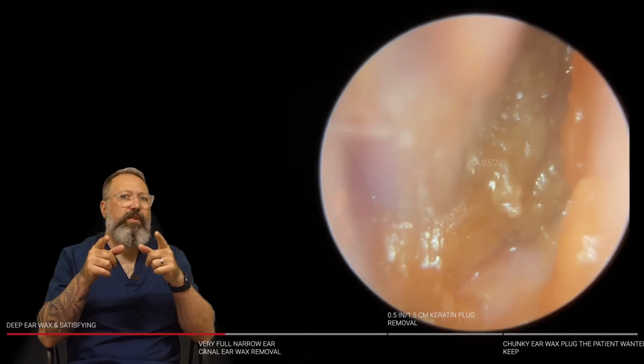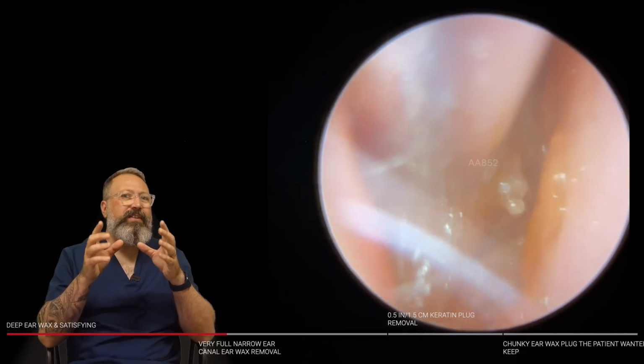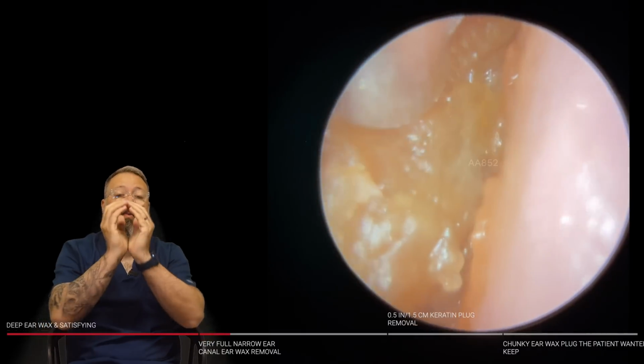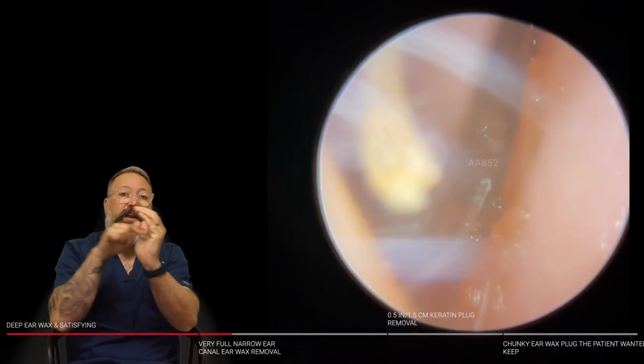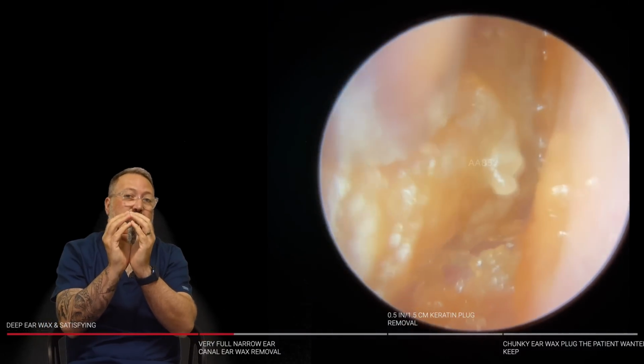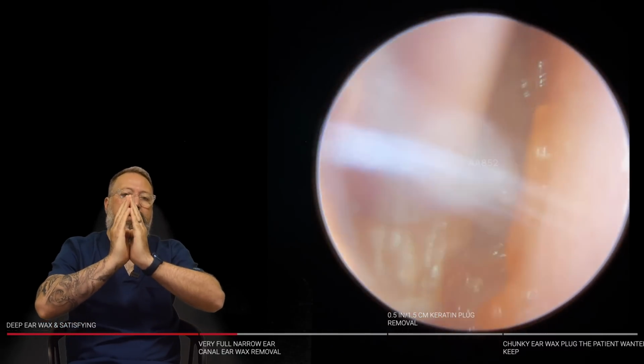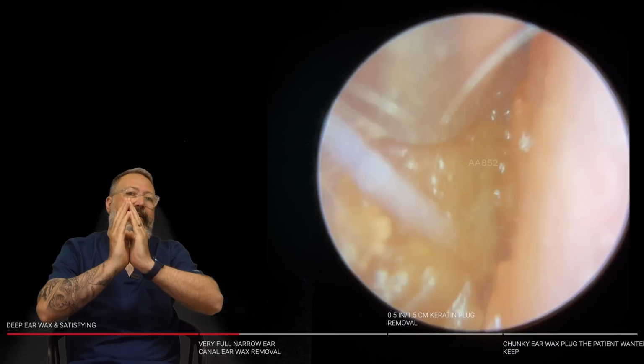Yeah, it's quite a narrow one, and this is hardened up perfectly into the shape of the canal. Always more difficult to do, basically, because when you've got a canal this size, you've got plenty of room back and forth. You can get in there with lots of different tools. You've got plenty of room to maneuver. When you do this to the ear canal entrance, that maneuverability drops quite considerably.